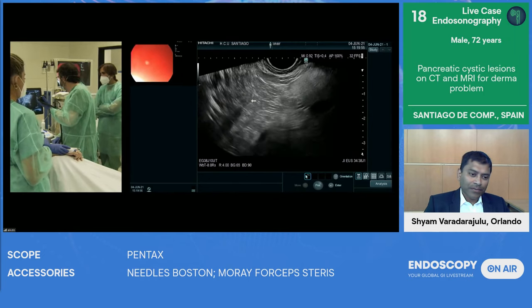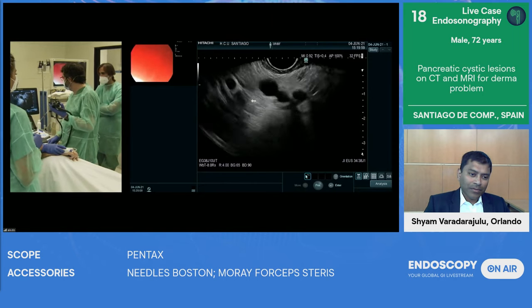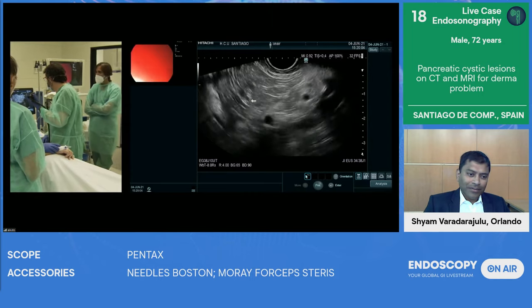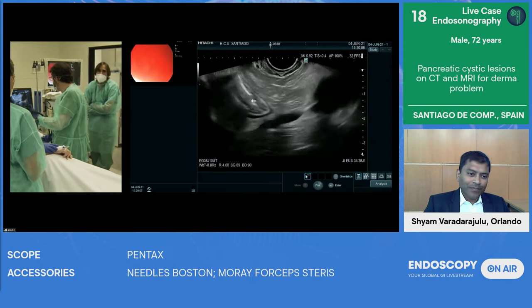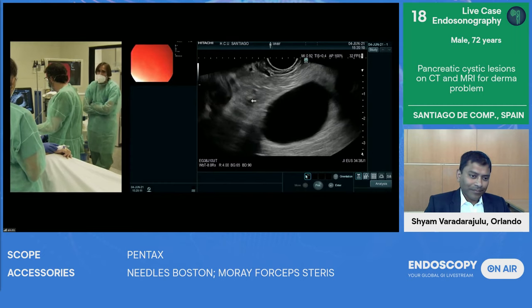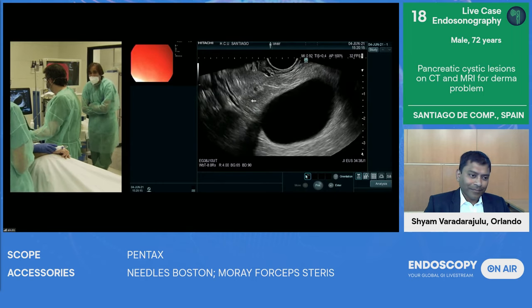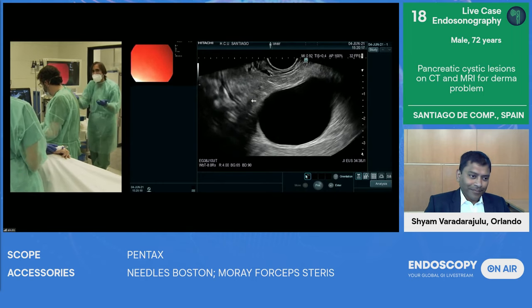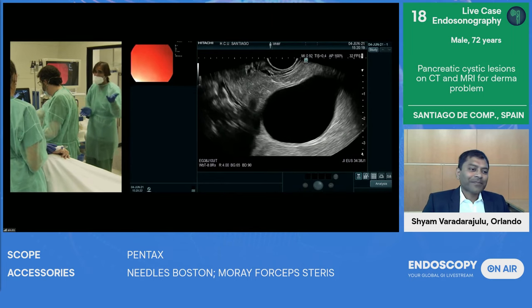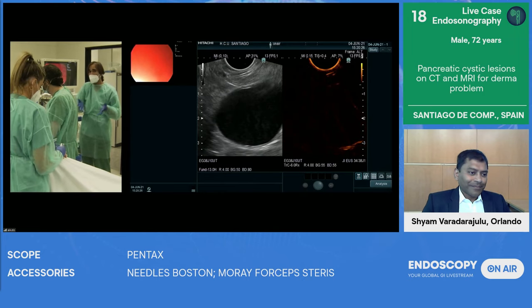I believe that is a very good observation, because from my experience, my point of view, I don't believe that the contrast enhancement in this particular case has any kind of benefit, because we mainly use it when we have some kind of solid component inside the lesion, some mural nodule. But perhaps for the assessment of the walls of the cysts and to confirm that the walls are enhancing, that is different in the pseudocysts, that the pseudocysts are not enhancing at all the walls, perhaps it's a possibility to use it. But I agree with you that we prefer to use it when we have some doubts about the solid component inside the cyst.